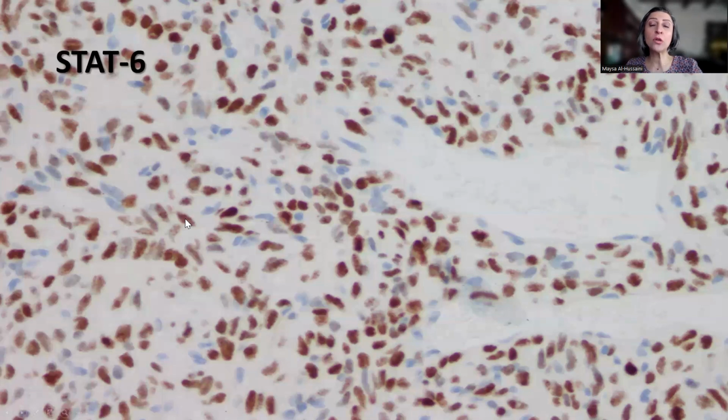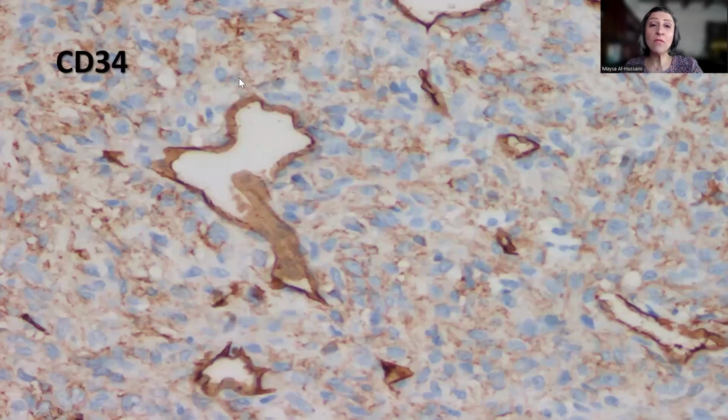Now, remember, in order to ensure that my immunostain is working properly, I have to have an internal negative control in this case, because normally there shouldn't be any tissue that would stain with STAT6. So the normal endothelium, for example, would be completely negative, while the tumor would contain the STAT6 staining, which corresponds to the mutation.